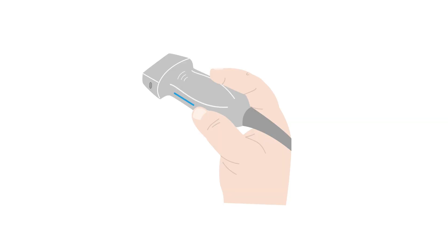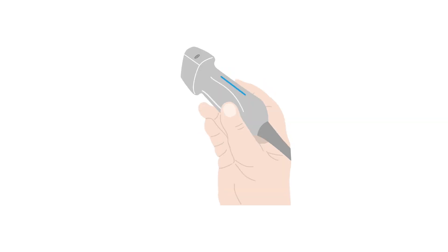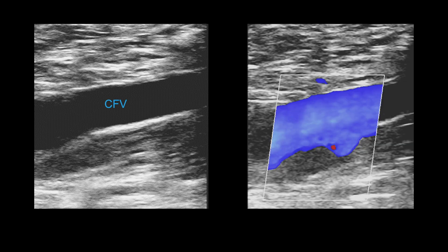Turn the common femoral vein into 2D longitudinal, or long, view to investigate for any intraluminal echoes, looking for any gray or bright tones within the vein that might indicate a thrombus. Staying in long view, press the color button to check for any filling defect that could also indicate DVT. Both images here are normal.